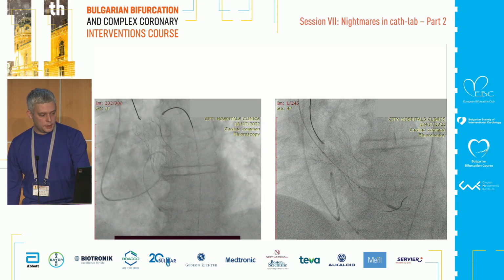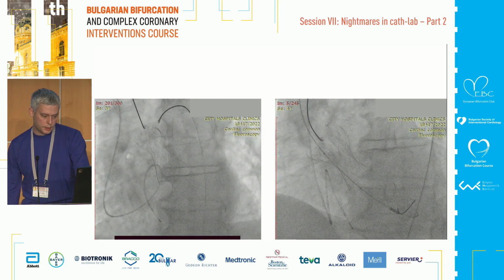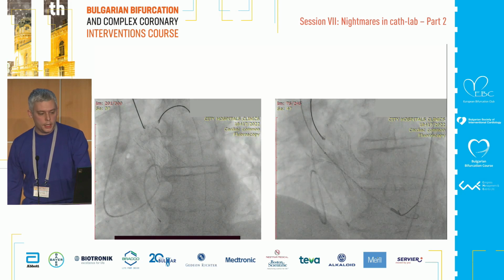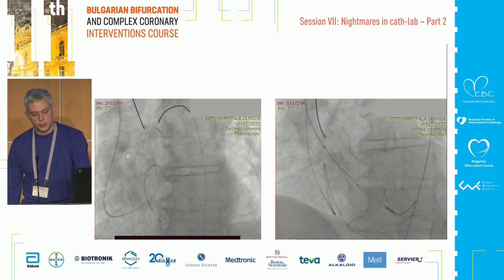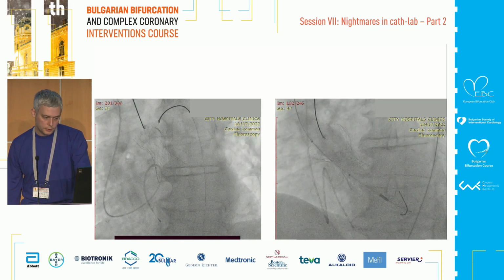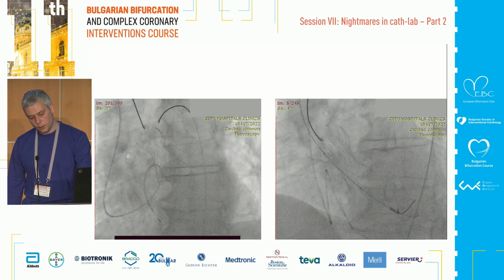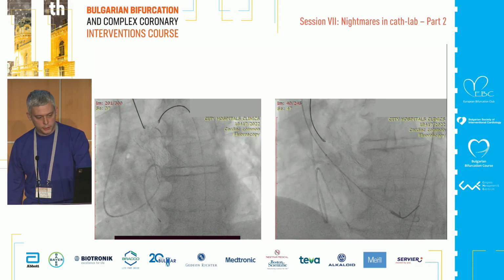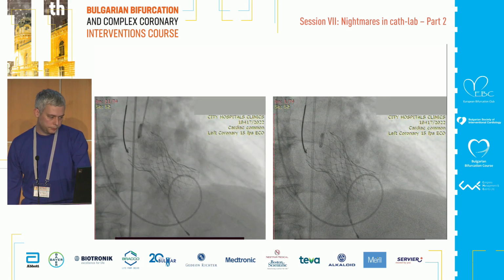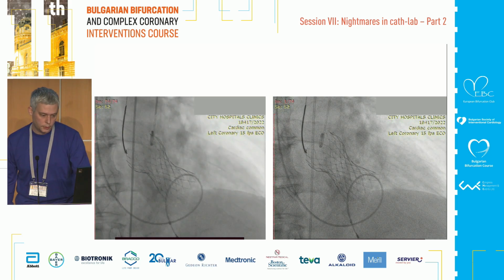So we made the same traction as in the patient before, by 2 gooseneck snares. After that, in this case, post-dilation, but only because the nitinol frame is not well expanded. So as you can see, better expansion is achieved, probably not the optimal one, but the best possible in this case. And here is the result after traction and post-dilation of the valve.